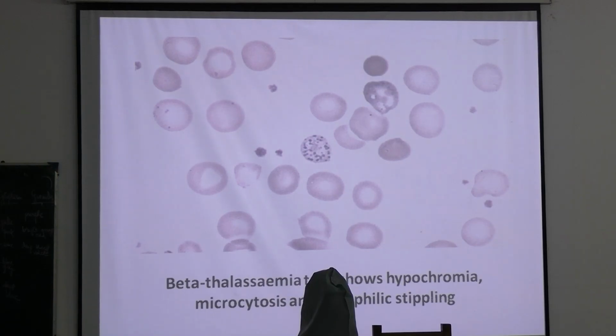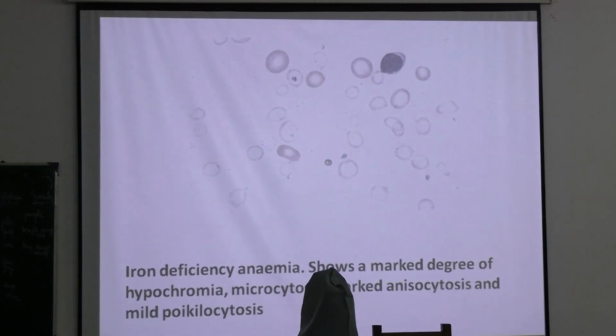Okay, this is the defect seen in RBCs in case of beta thalassemia trait. It can also be seen in lead poisoning. Have you heard about lead poisoning? Basophilic stippling is very characteristically present in that case. But it can also be seen in many other disorders. One of them is beta thalassemia trait. Clear?